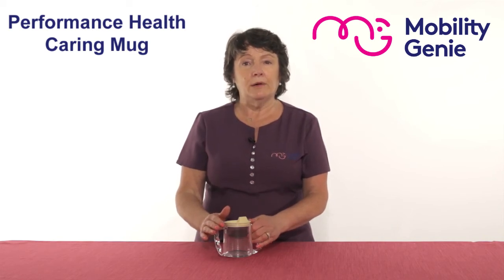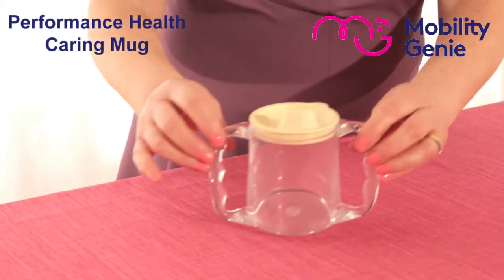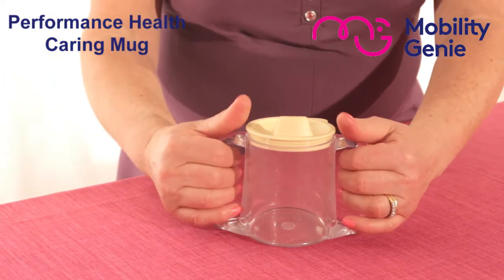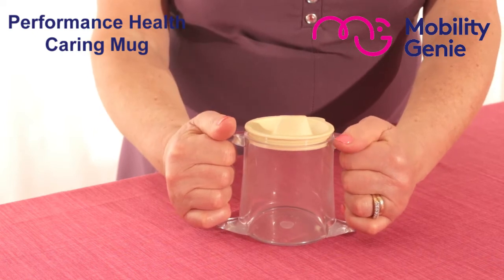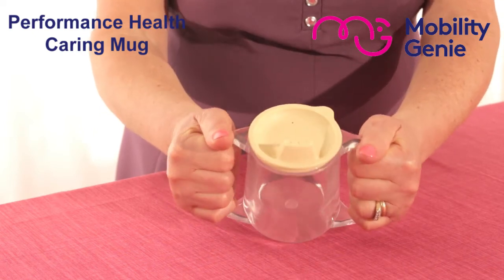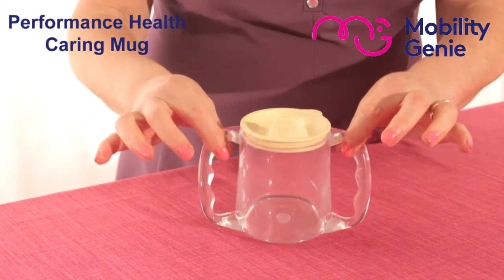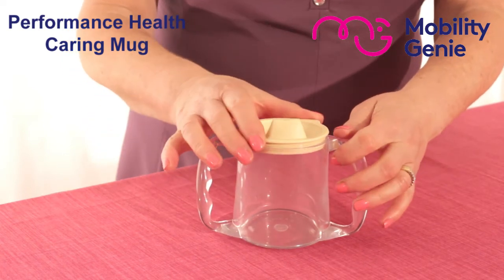So this is a Performance Health caring mug. It's got ergonomically designed handles — in other words, the fingers fit around it easily for an easy grip. It's quite heavy in weight.